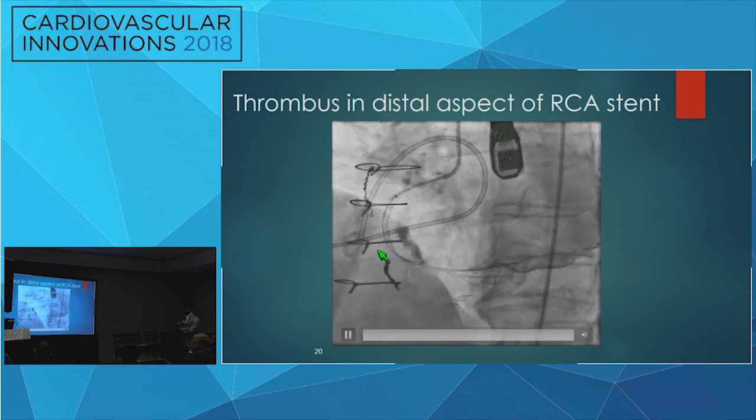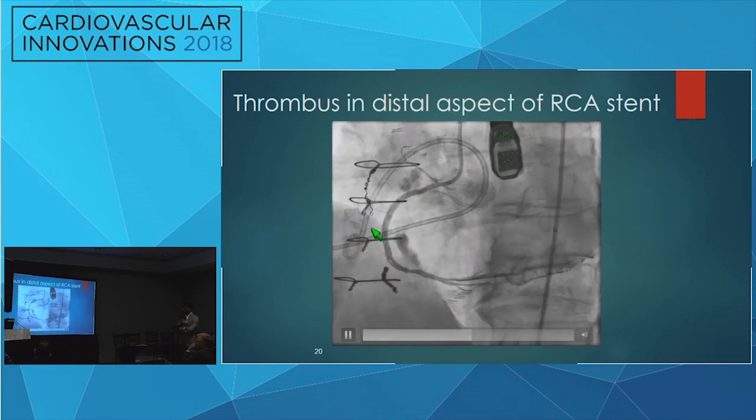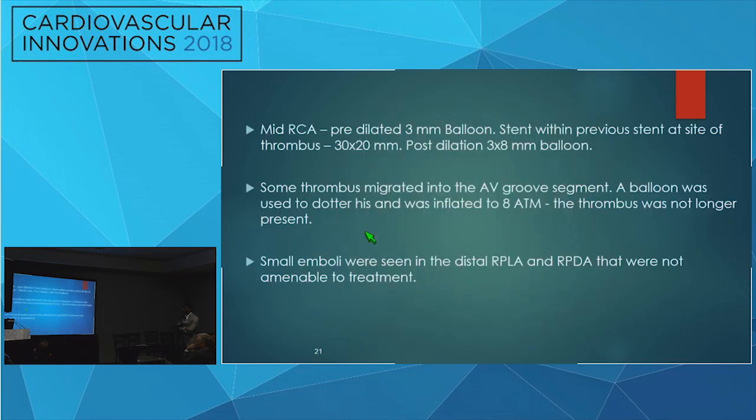So at this point, we were very convinced there was no residual flow. There's no blush that we kept seeing here. I mean, this little flow, I don't know, I'm not very convinced, but that was actually really a lot before we closed this. So after this was done, and obviously, when someone is bleeding, we cannot, we just put in stents in this patient. We cannot be using anticoagulation. Very high risk of stent thrombosis. So it's a major risk when somebody is perforating and bleeding. You cannot use anticoagulation. You're risking a stent.